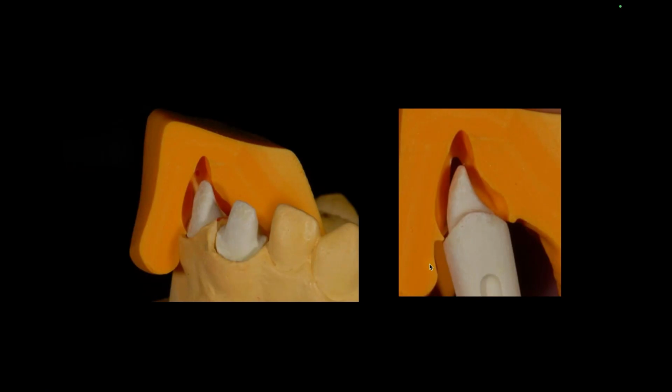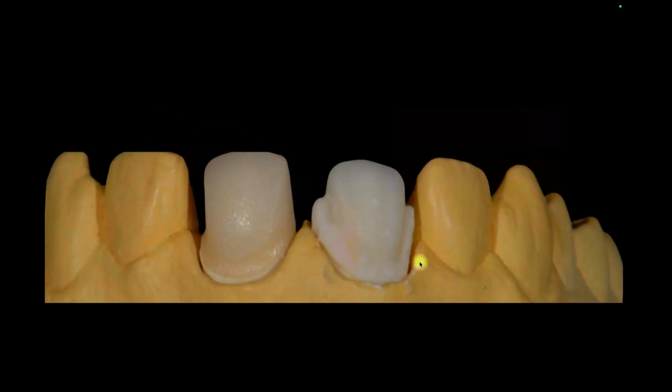So this is just for fun. I'm going to make the crown A1 like the doctor asked for. So here we go. I'm not going to use any fluorescent materials here, by the way. I'm only going to use dentins and opacious dentins. So on the tooth here, which is actually the number 9, I want to make it A1. So what I'm going to do is actually go to a highly opacified opacious material.